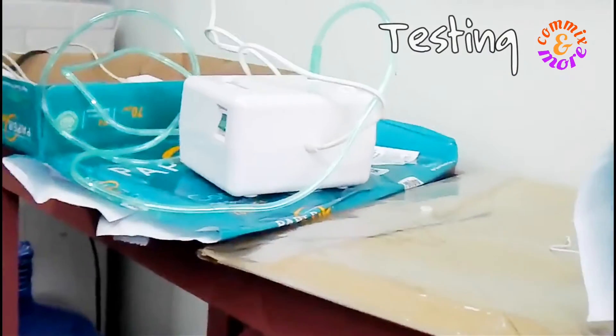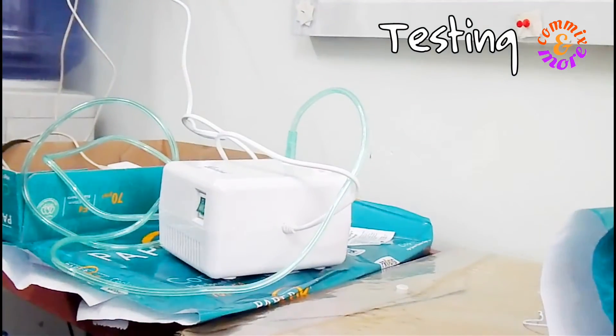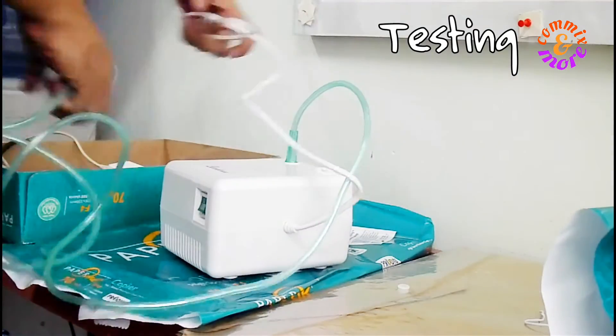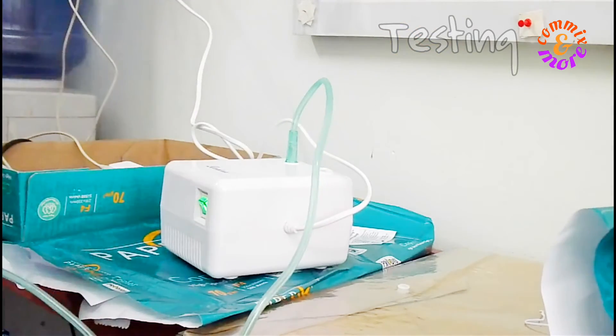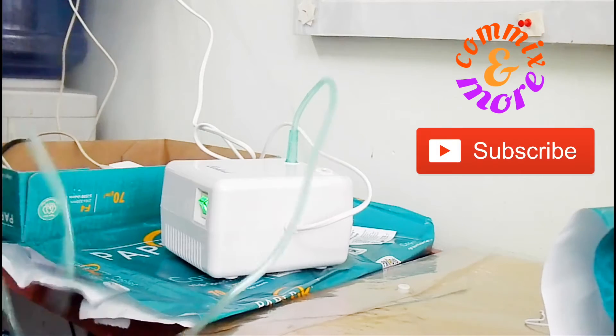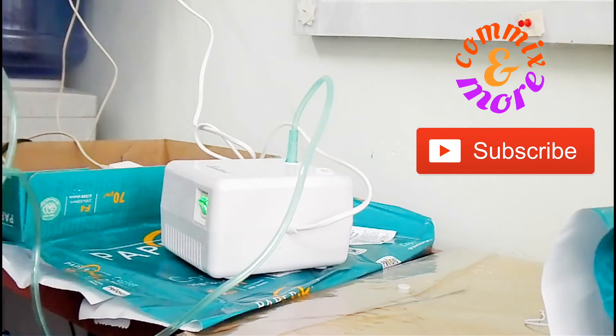Now let us try if it works. And yes, it works. I can feel the air passing through the tube.